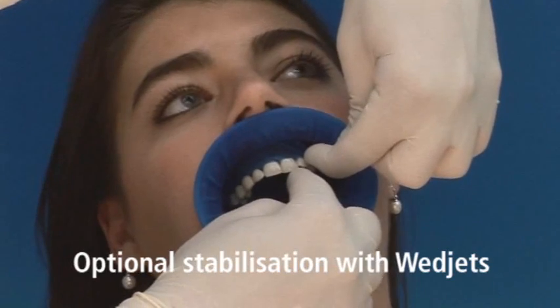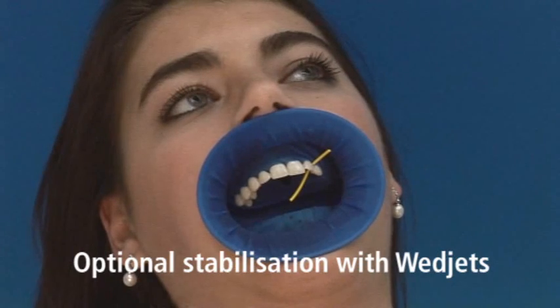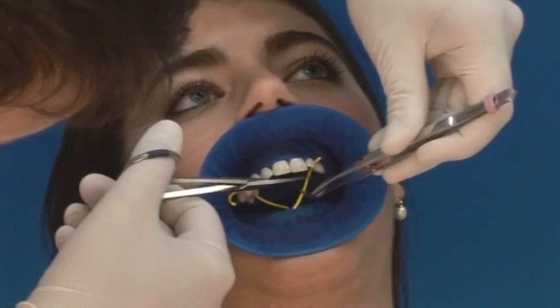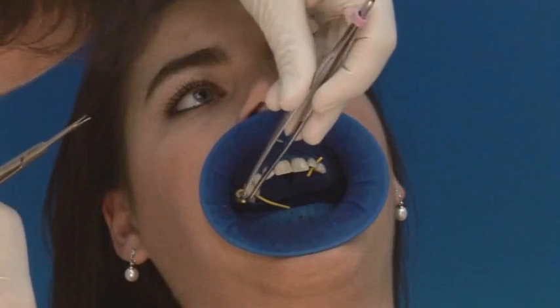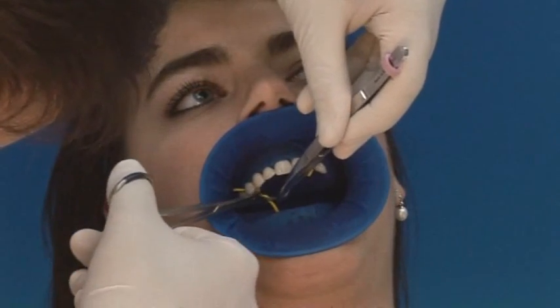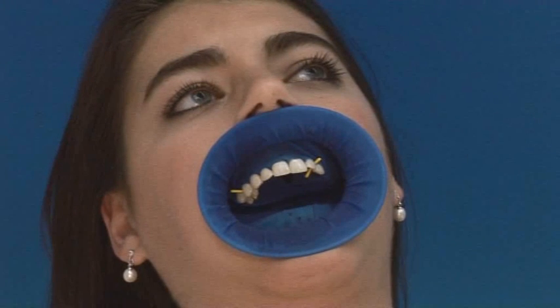In rare cases, this automatic retention around the tooth may not be sufficient. Under such circumstances, wet jets can offer additional stability. Wet jets are highly elastic cords which ensure additional stabilization in interdental spaces in a gentle way. To position them, the wet jets are stretched and advanced beyond the contact points similar to dental floss and placed in the interdental space. On releasing the tension, the wet jets regain their original shape, resulting in automatic additional fixation of the Optredam.